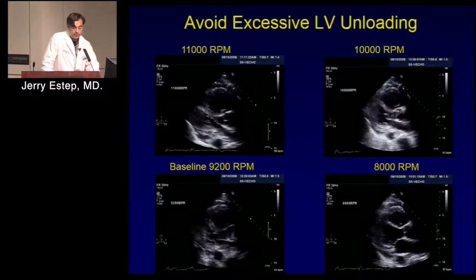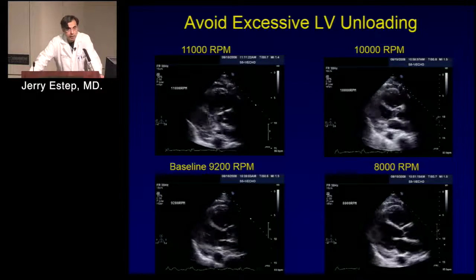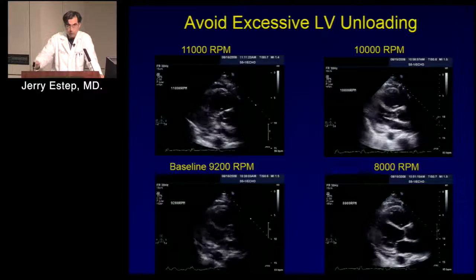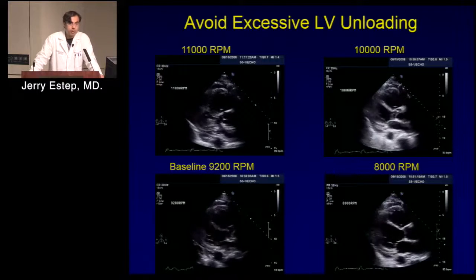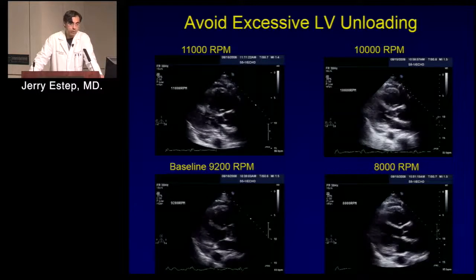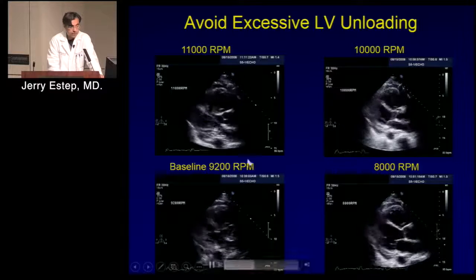Now, for speed optimization outside of that one per-protocol visit, we're doing it on the back end. And so really what we have been doing, and I'm going to show you the expectation from the reports that we'd like to see and how it would be read to help us, we're looking at the raw data. So we pull up the echo report, look at the different pump speeds. We know the clinical scenario. Now, if they're asymptomatic, we typically order just a surveillance echo. If we're ordering a pump speed optimization, it's because we think we can fine tune the pump speed to something that's better. And we don't want to go overboard, as exemplified by here.